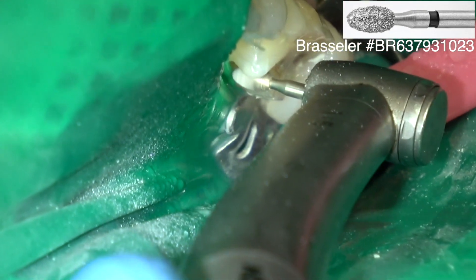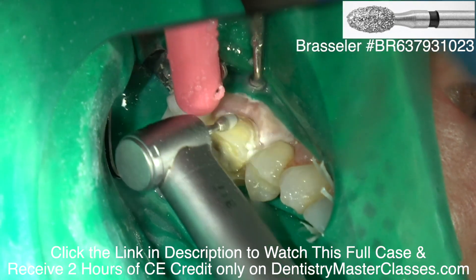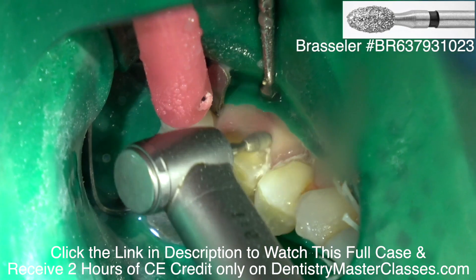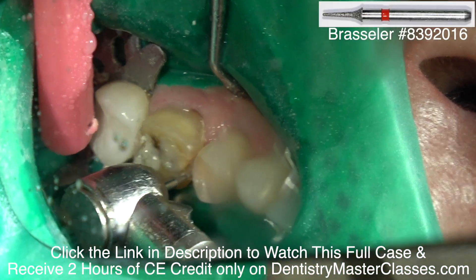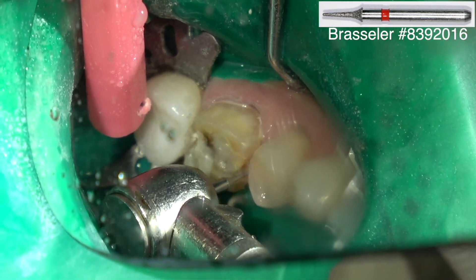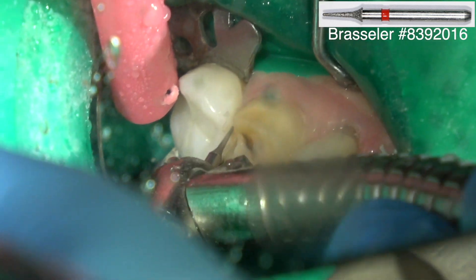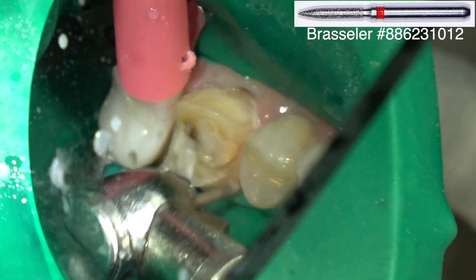I use the coarse football diamond because it cuts pretty quickly and you can do the general part of the preparation with it. Then I'm coming back with the mosquito diamond and just breaking the contact between the tooth being prepared and the adjacent tooth. Try not to touch the adjacent tooth if it's not being prepared for a crown. This is a flame-shaped fine diamond.